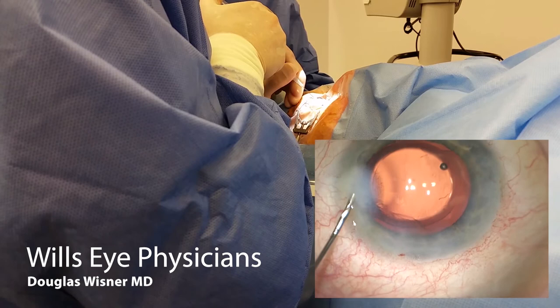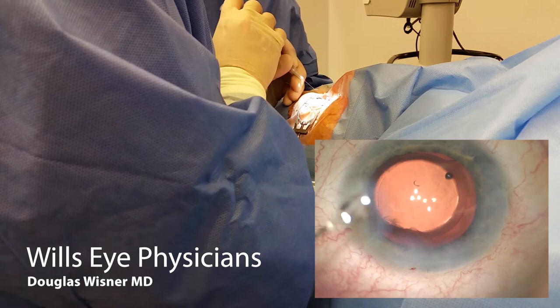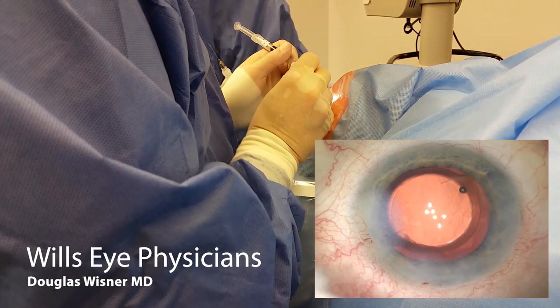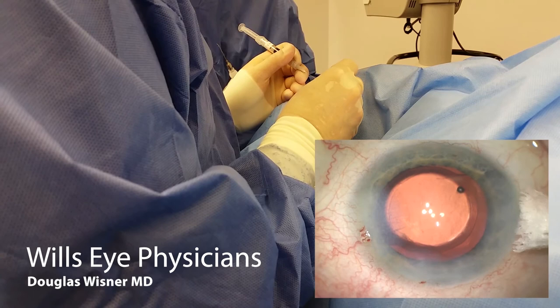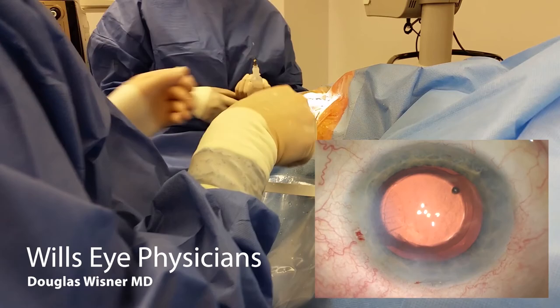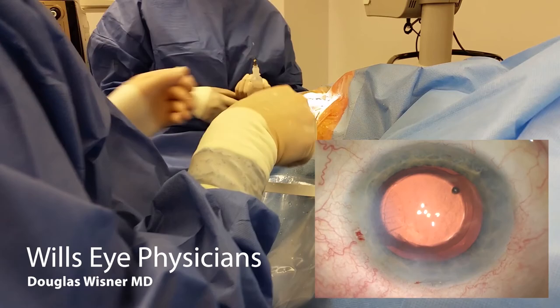Just adjusting the pressure a little bit, a little bit more hydration. You'll notice when I'm checking for leaks, I'm just dabbing at the wound — I'm not scraping along it. You can create an abrasion by dragging the Weck-Cel along the cornea. All right, we're all done. Thanks very much for watching.